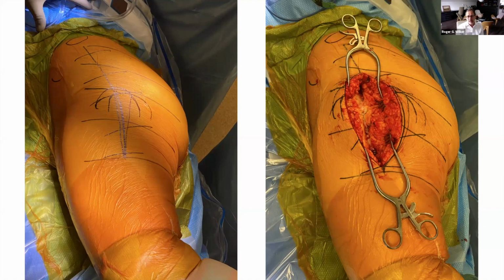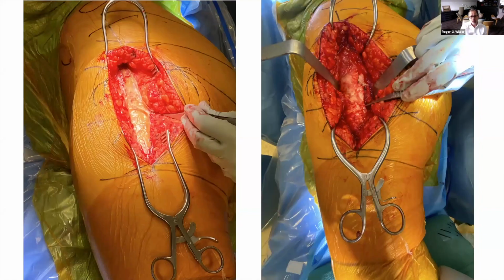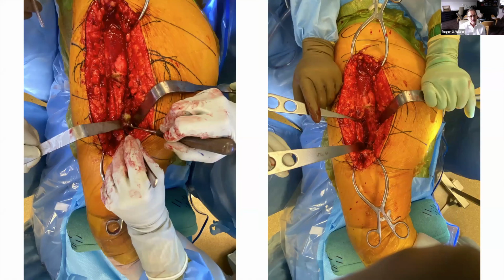The lower end of the Gibson really is the approach to the proximal femur, where you split through the fascia. And then, very importantly, you go around the backside of the vastus and cleanly dissect that off. Here you can see Brett is using an elevator. A very sharp elevator is one of the best dissecting tools for taking the fibers of the vastus lateralis off the intermuscular septum and off the lateral border of the femur.